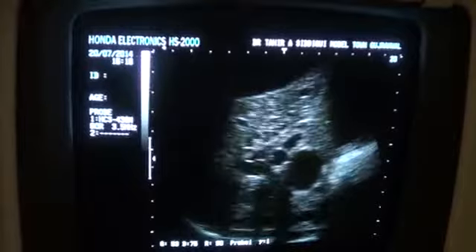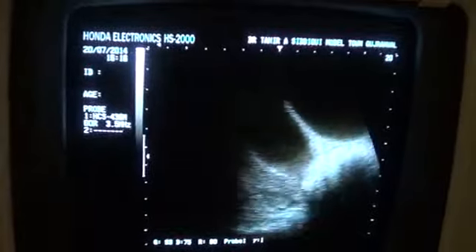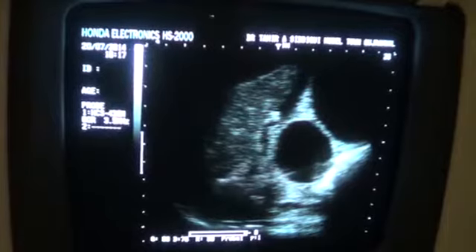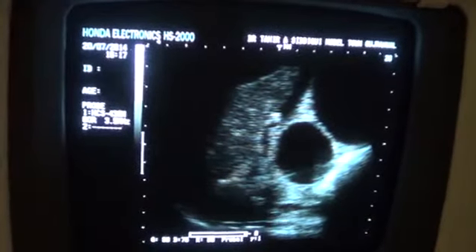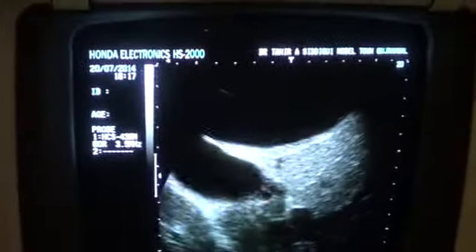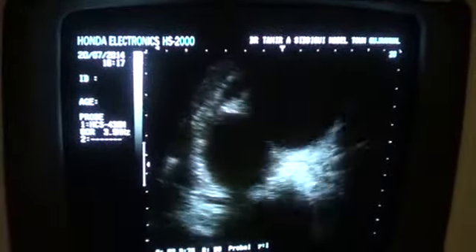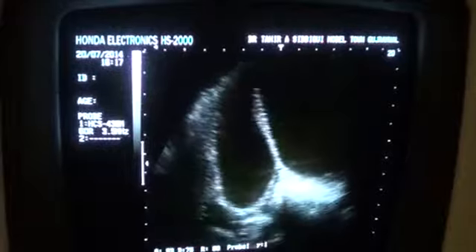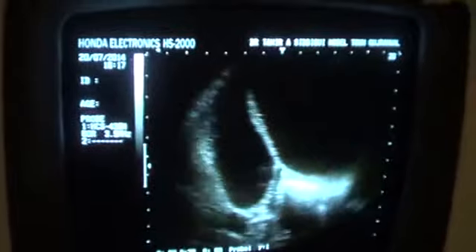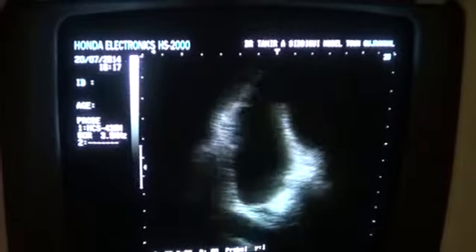Even with the patient in left lateral decubitus posture, it's not easy to get the common bile duct ascended. Now this is the same view that you were seeing with lower magnification, and this is with higher magnification, in an attempt to see if there is any obstruction at the level of the cystic duct or common bile duct.